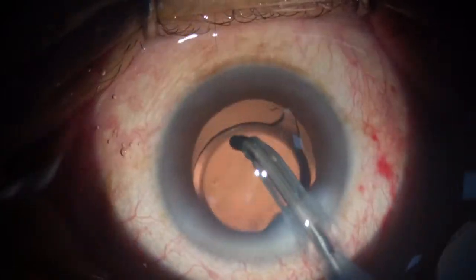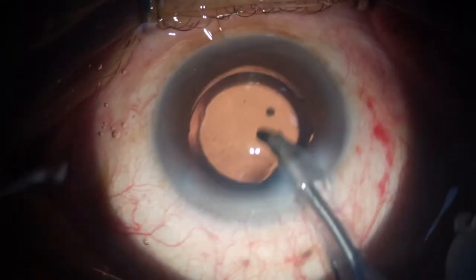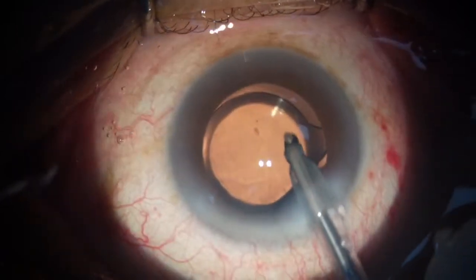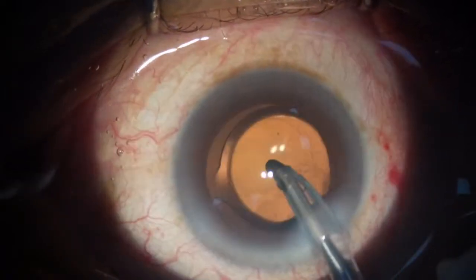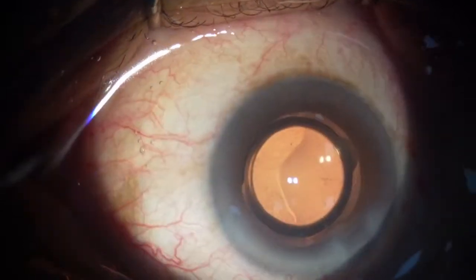I am also going to rotate it slightly so that I'm keeping it temporal and nasal orientation of the haptics, and I'm slightly pushing it towards the nasal side. I'm not very sure, but there were a few studies which said that the negative dysphotopsia is a lot less if we are decentering the lens a little bit.